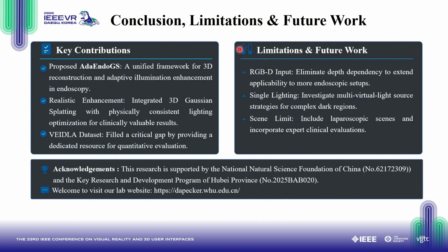In summary, our work has 3 key contributions. We propose AdaEndoGS, the unified framework for endoscopic 3D reconstruction and adaptive illumination enhancement. We achieve clinically valuable, physically consistent dark region enhancement by integrating 3DGS with PBR-based lighting optimization tailored for endoscopy. We construct the VEIDLA, filling a critical gap for quantitative evaluation of endoscopy illumination methods.